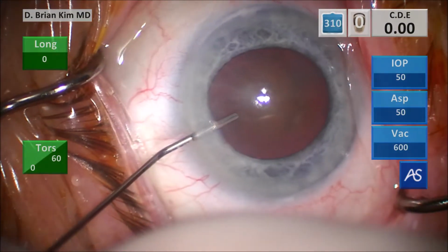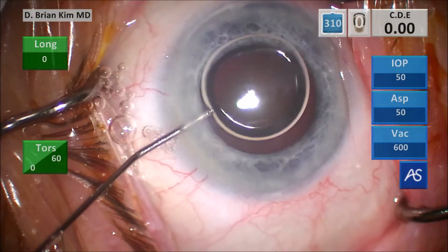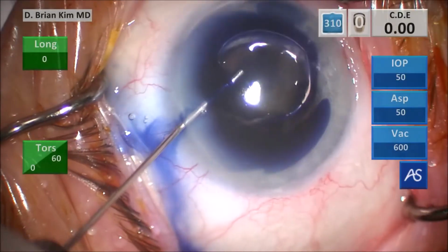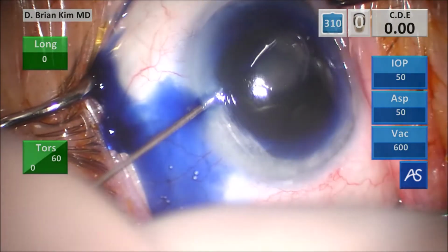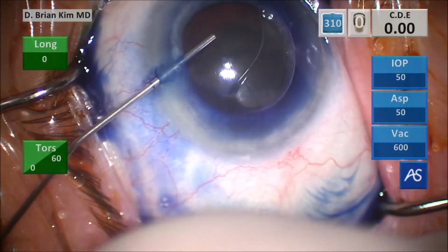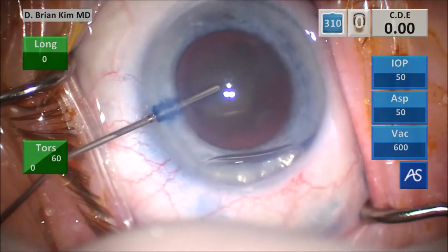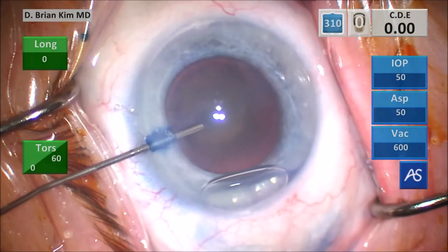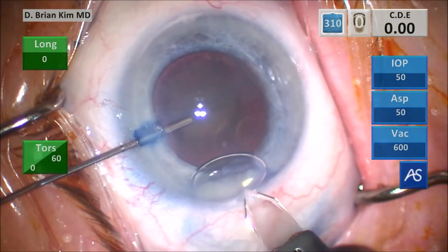This is intracameral epinephrine, and then some intracameral air for the trypan blue. Here's the trypan blue. The air bubble didn't stay very well, but I'm going to try to paint the anterior capsule surface and try to use a minimal amount of trypan there. This is some dispersive viscoelastic to push the dye and the air bubble out, but also to coat the corneal endothelium and flatten the anterior capsule.